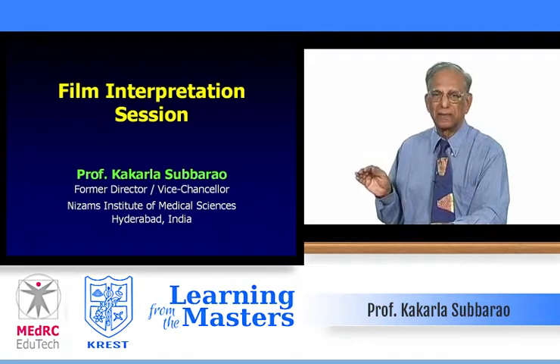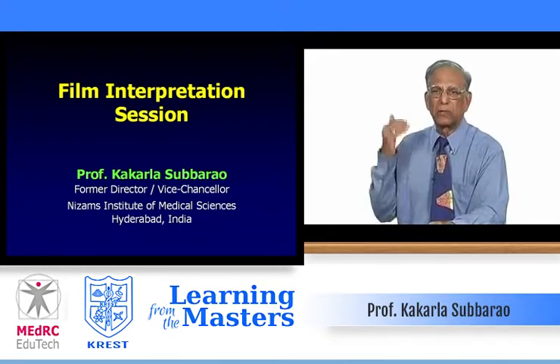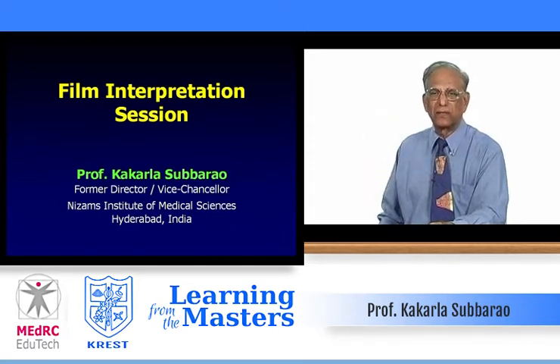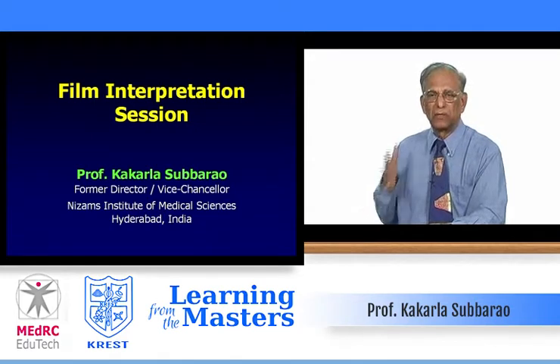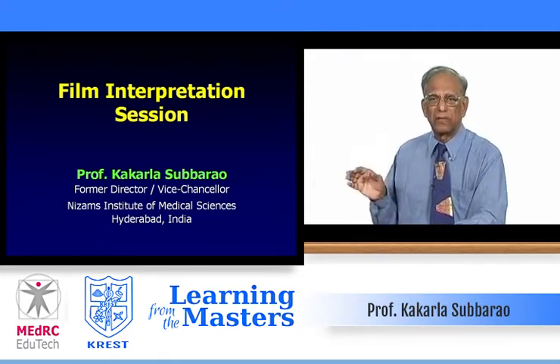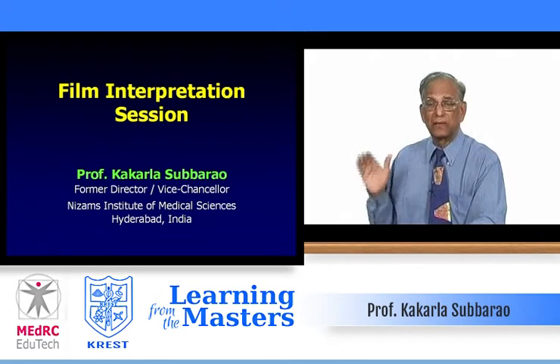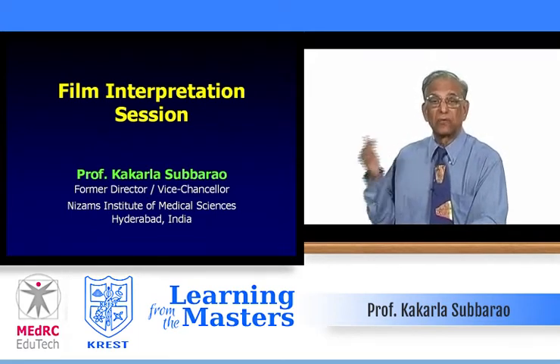It is to teach the students how an expert approaches a film. Given a short, brief history, how does he approach the film? What does he find, radiological findings, and then how does he interpret in pathological terms, and what will be the differential diagnosis, and ultimately the final diagnosis, what he thinks it is. That is what is called film interpretation session. And then he may also suggest further investigations.